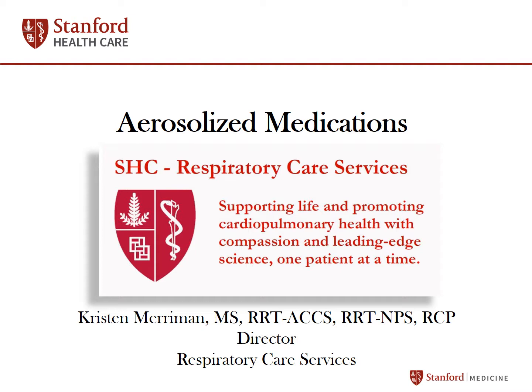As a respiratory care practitioner working in an academic medical center, you can expect to receive orders to nebulize medications not discussed within this module. To ensure medical director approval for an ordered procedure and to get advice for administration, consult a supervisor when asked to nebulize medications not discussed in this module.